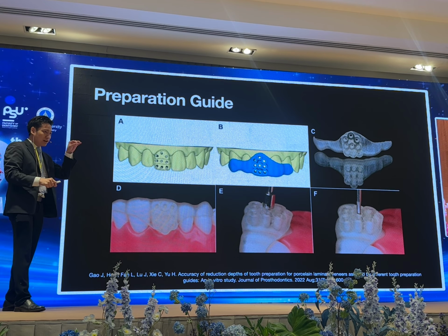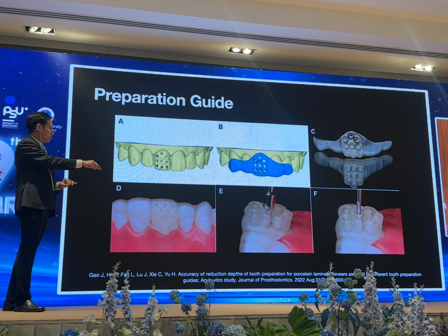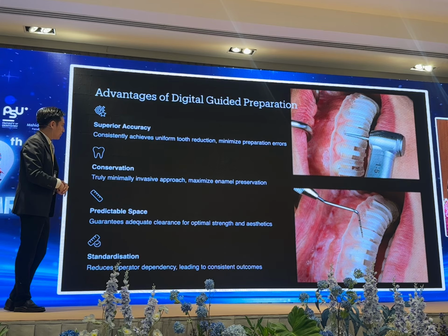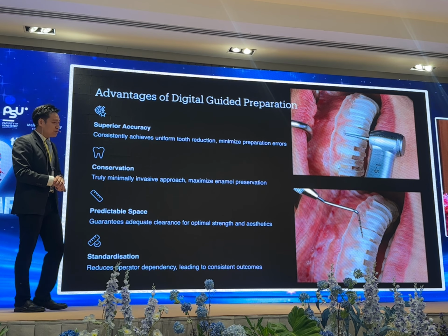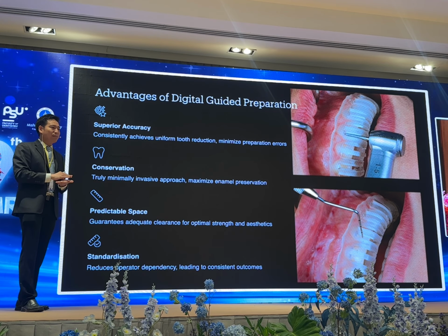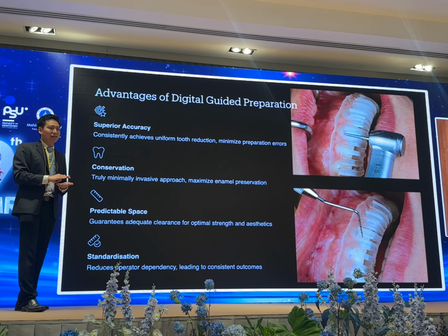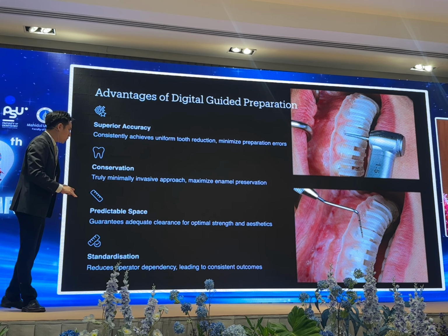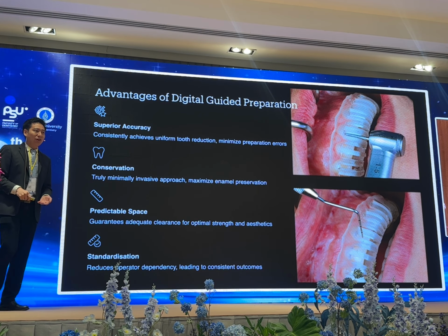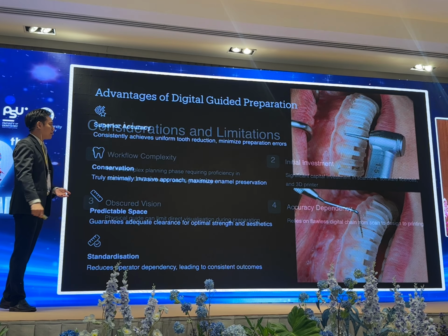Because the burr will just go in to the end of the hole, and you get a dipping on the surface of the tooth, and you guide your preparation. So when you use a digital guide, it utilizes that technology and makes it more predictable. You reduce less tooth structure. You have more control, and you can standardize. You don't need to rely that much on the skill of the operator.